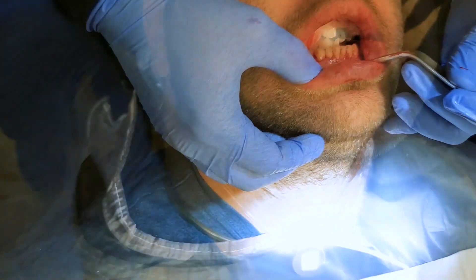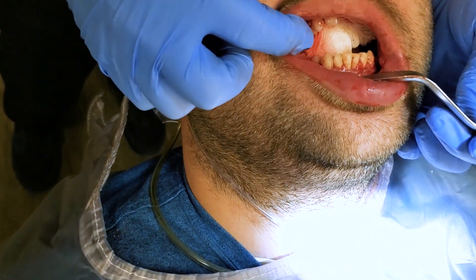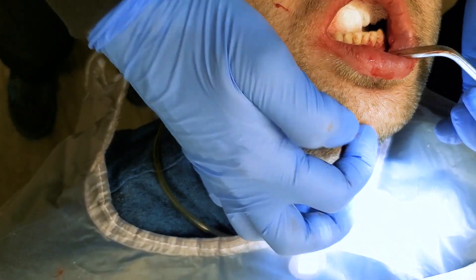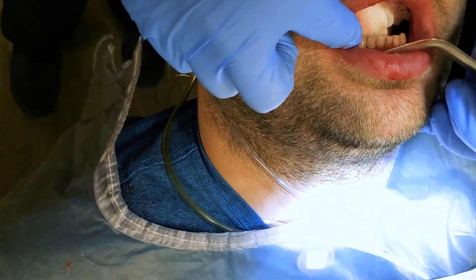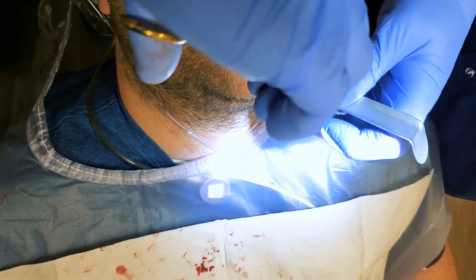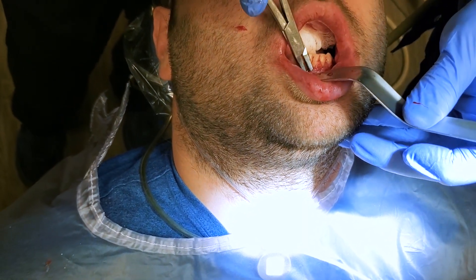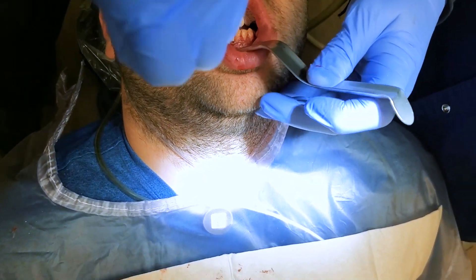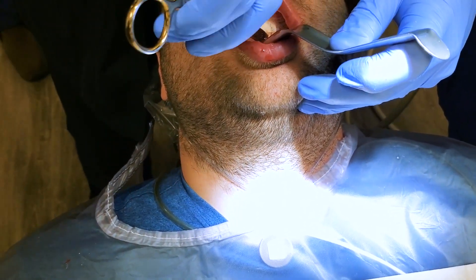The arch bars are now gone, but what we're looking at here is this wire — a circumdental wire that was used when the jaw was broken down through here to bring that segment together and get his teeth approximated. It goes around the teeth. Let's get a wire twister and go ahead and just unspin this wire, kind of get it up and available. Now I'm going to start to untwist it a little bit.